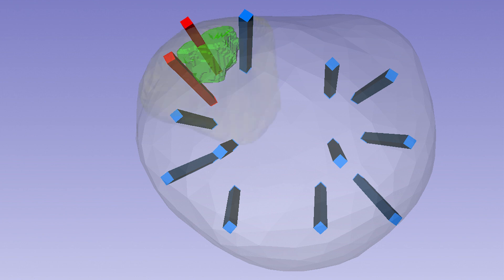By mapping them out in 3D, we can create a treatment margin around the tumor that includes all positive cores and excludes negative ones. This approach treats the tumor while sparing most healthy prostate tissue and preserving quality of life.